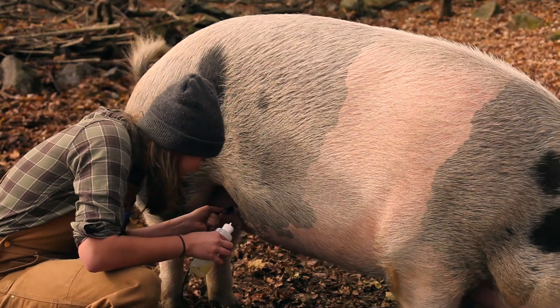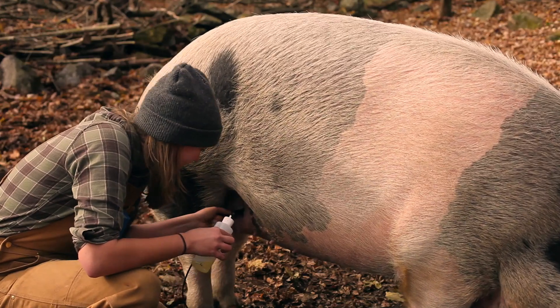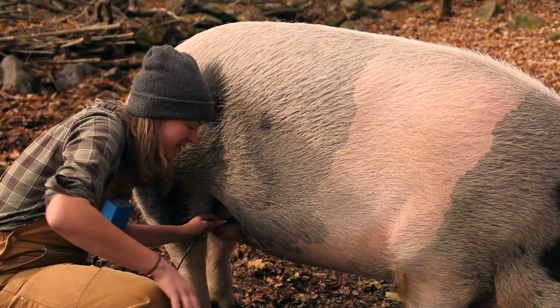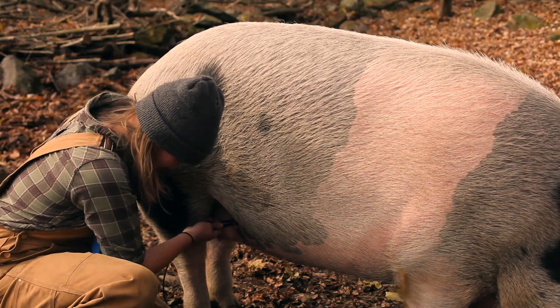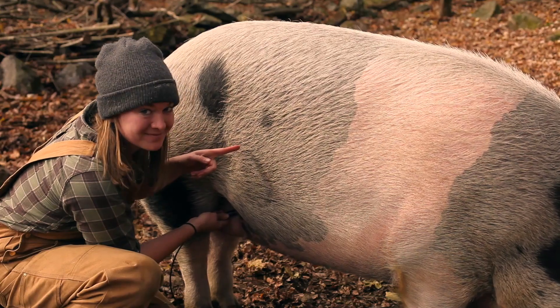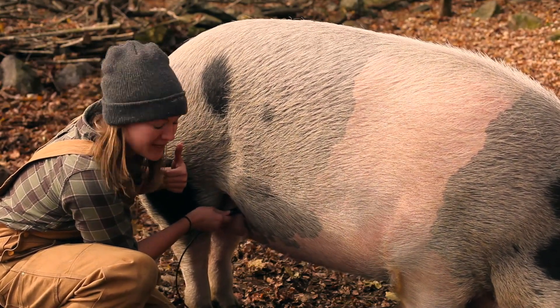I'm calling that pregnant. That is solid tone. The probe is pointing up towards her front left shoulder. Her bladder's back here — no way it's picking up on that.